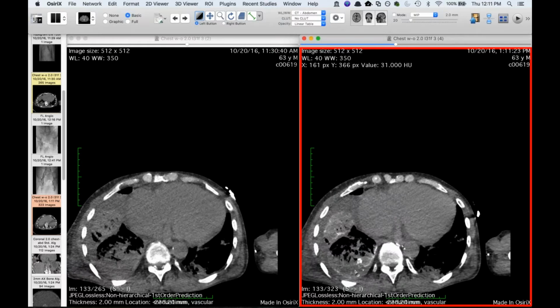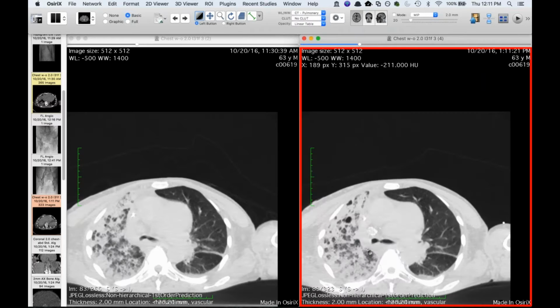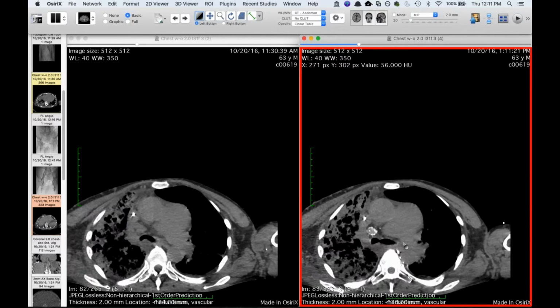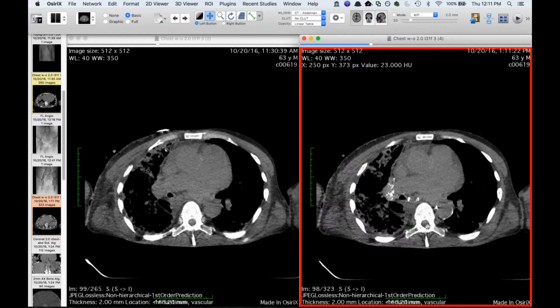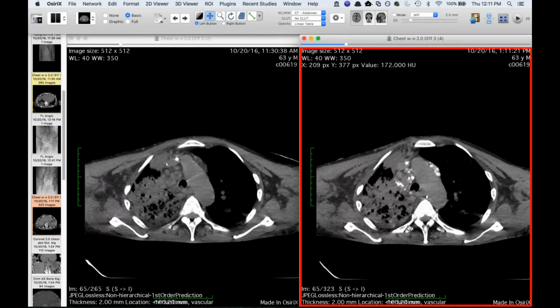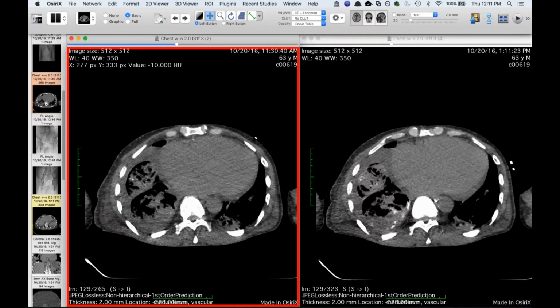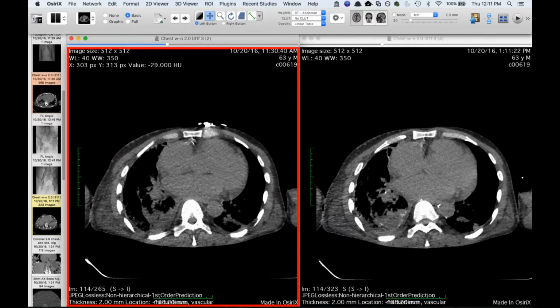So this is all Lipiodol that has ended up, I guess, in the lymphatics of the lung, since it's also in these mediastinal nodes, which Lipiodol has been reported to embolize, like in the setting of some sort of arterial embolization, like in the liver. I can't find any reports of it spreading via the lymphatics into the lung like this. Moreover, it's like a retrograde spread into the lymphatics of the lungs, which I just think is fascinating. I've never seen this before. I don't know, Howard, if you've seen anything like this, but this is just crazy.